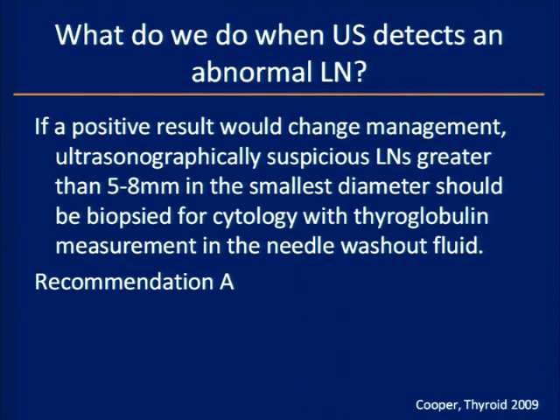And so from there, if we look at what the guidelines recommend, they say that if you see an abnormal lymph node and diagnosing that would change your management, it is something that should be biopsied. You can send it for cytology. You can also wash out the fluid that you use when you biopsy a lymph node, and send it for thyroglobulin.